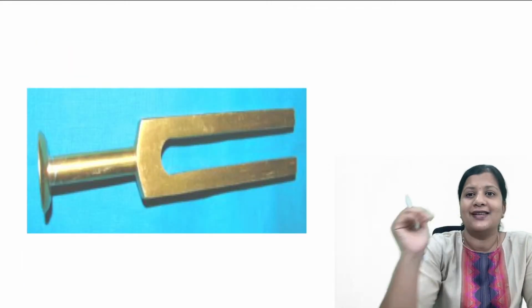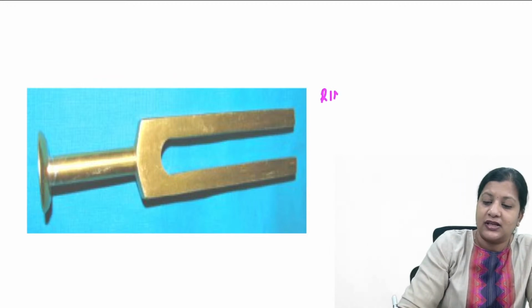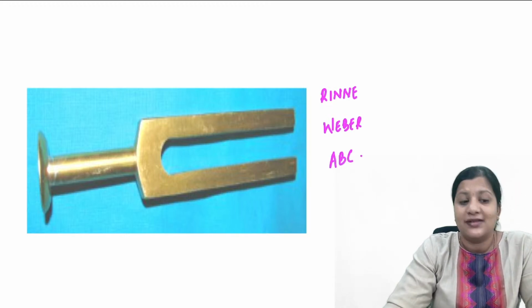Can you all tell me what this is? This is something that you have already seen. We have done Rinne's test with this. We have done Weber's test with this. We have done absolute bone conduction test with this. What is this instrument that we commonly use in the OPD?